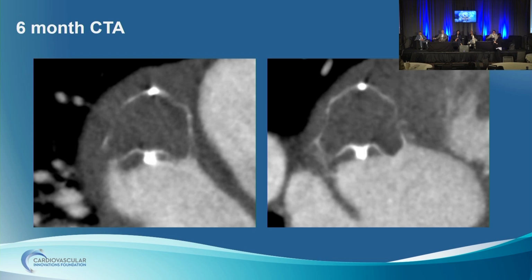We haven't made a decision yet. Hot off the presses. The panel on the right still looks below the fabric cap. I'm a little more concerned about the panel on the left, and it looks to be a little bit more progression of this low attenuation on the atrial side of the device. I think if you're concerned, I would add antiplatelet therapy to this regimen. That is what I would do.